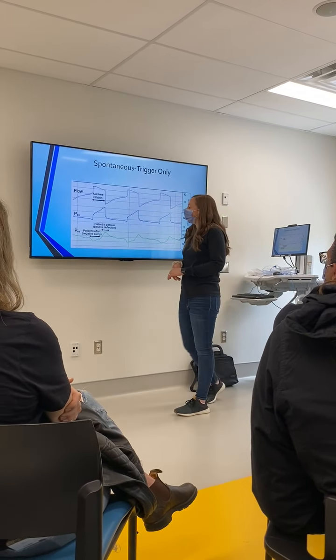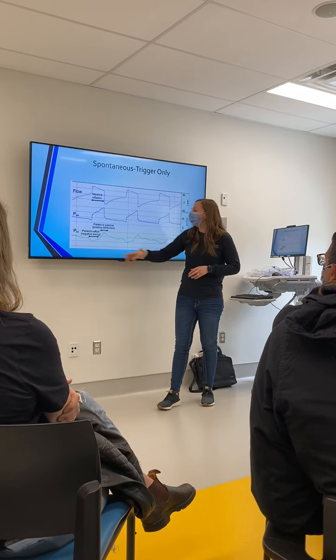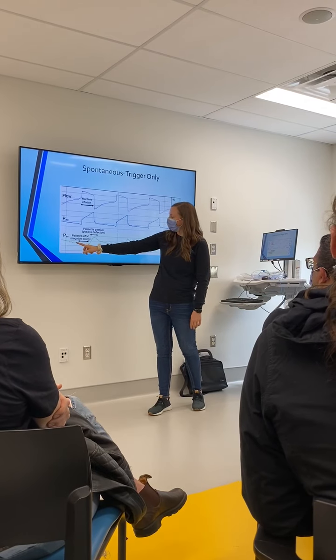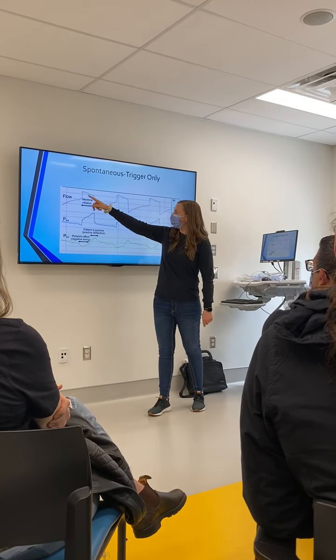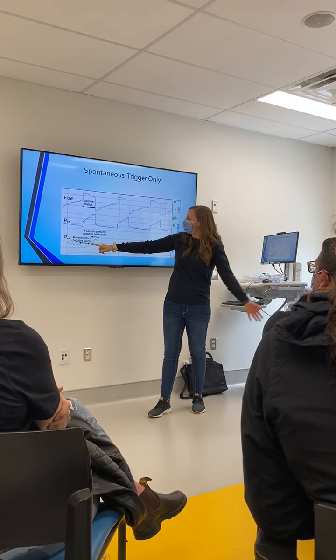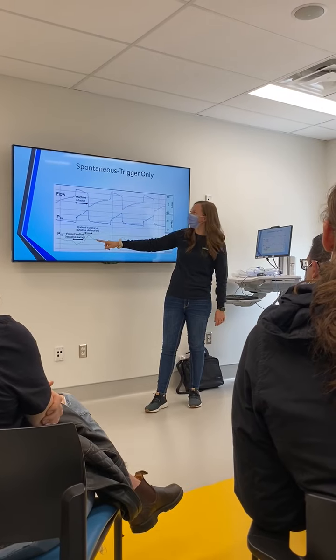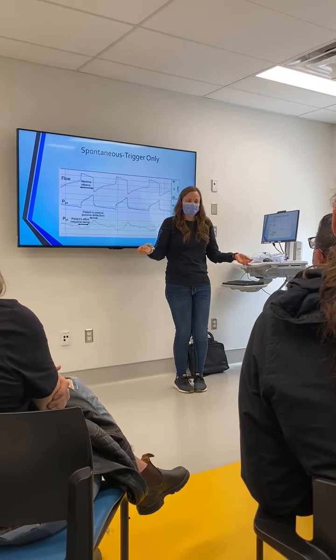This patient here is triggering in pressure support, but that's all they're doing. They're not fully sustaining their breath, the whole breath of the pressure support. Here you can see they start to breathe, so they trigger the vent, it gives a breath, but then they basically just stop and the vent pushes in the breath. So this is the whole breath. All they're doing is triggering and riding the pressure support.